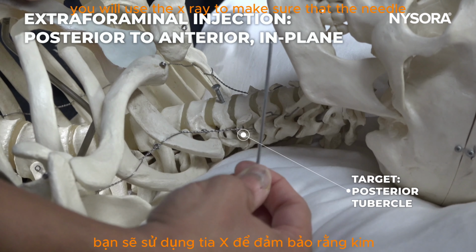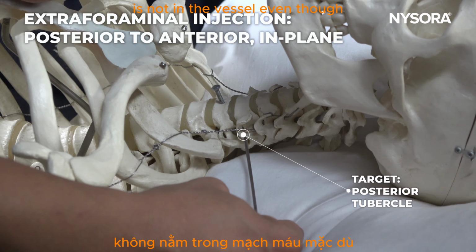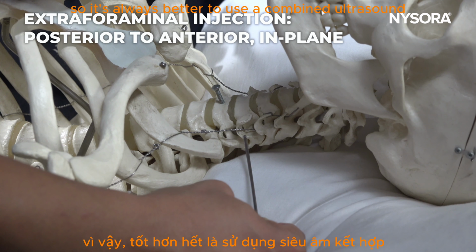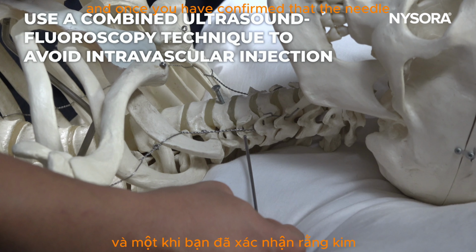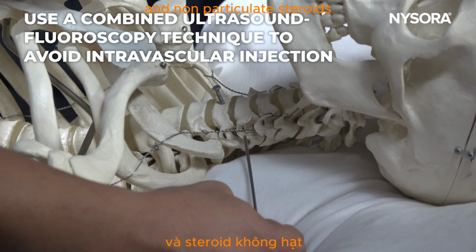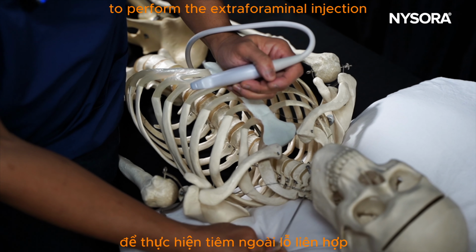You will use the X-ray to make sure that the needle is not in a vessel. Even though ultrasound is very useful to find the vessels, sometimes the vessels are so small. So it's always better to use a combined ultrasound and fluoroscopy technique. And once you've confirmed that the needle is not inside the vessel, then you'll inject the local anesthetic and non-particulate steroids like dexamethasone to perform the extraforaminal injection.